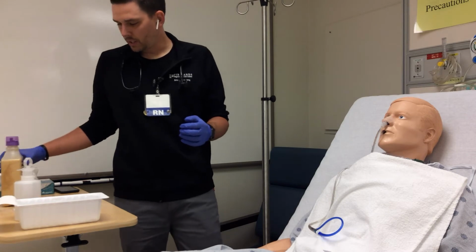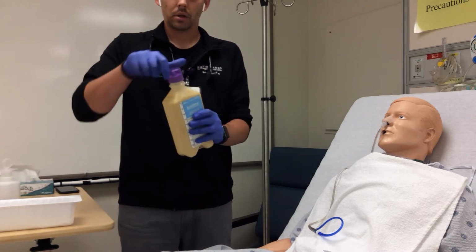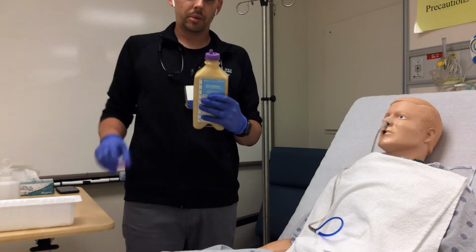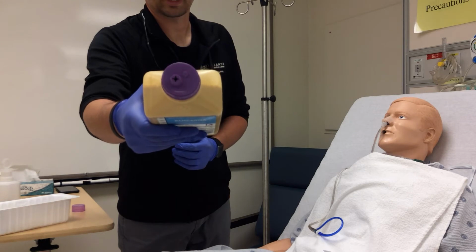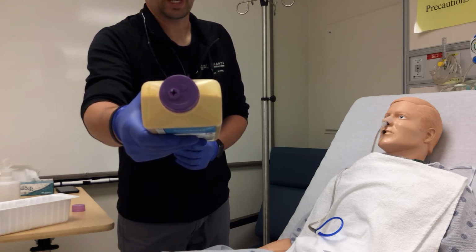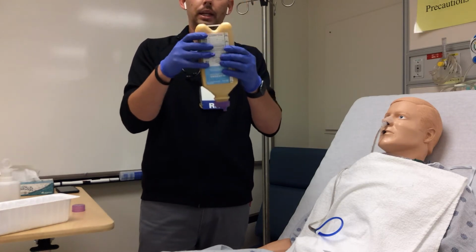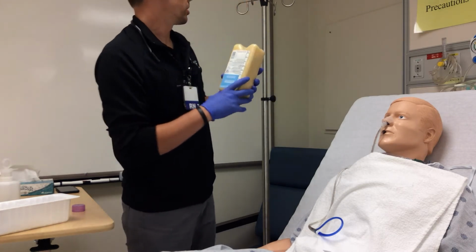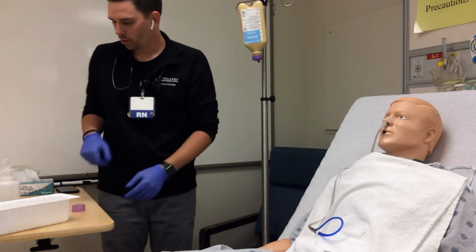Next, we are going to take our tube feed formula. Comes in a bottle like this. Lid pops off, and you'll notice it has a little kind of plus side opening, and that is where our tubing is going to connect to. Right now it's sealed. Nothing can come out until we spike it with our tubing. So we will hang this on our IV pole.